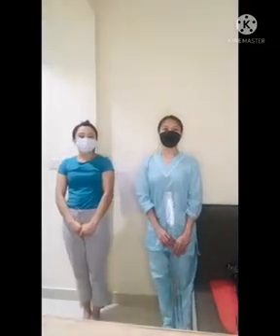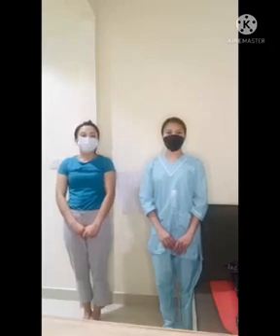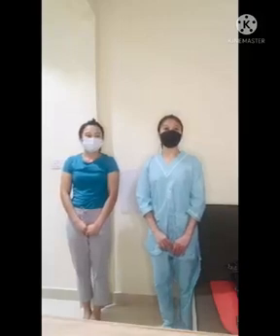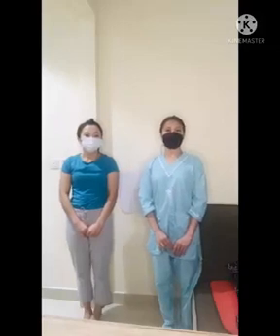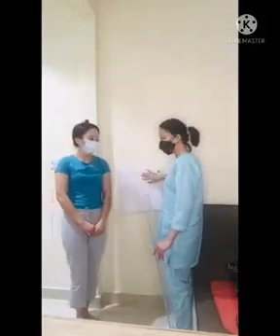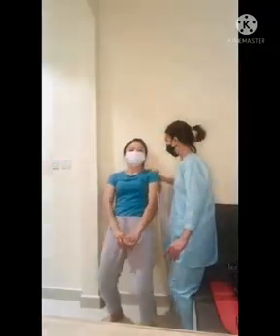For the last projection, it is the chest, lung apices, lordotic view. The projection that we're going to do is the AP axial projection, Lindblom method, lordotic position. So, the patient is in upright position, facing the X-ray tube. The upper border is placed 2 inches above the shoulder.